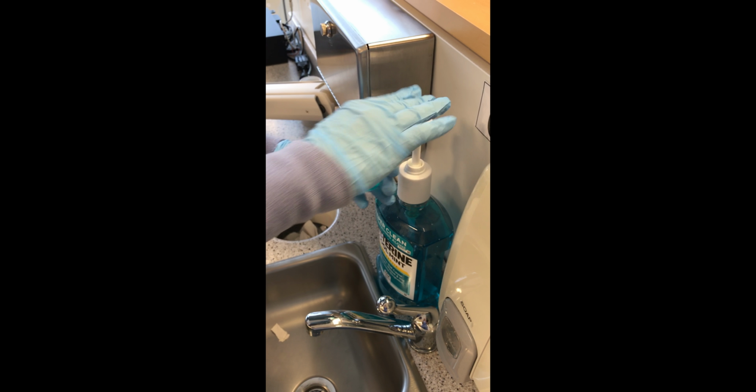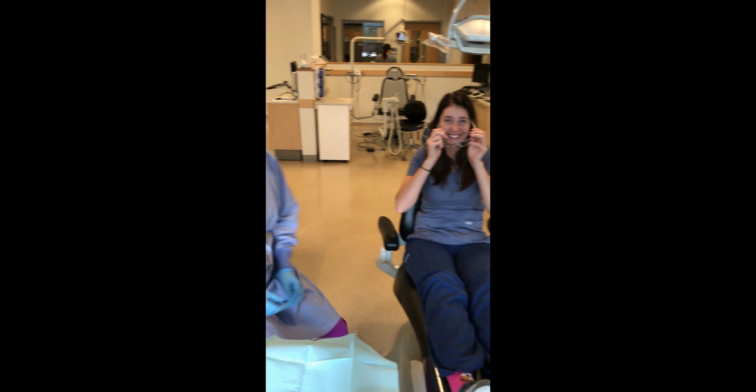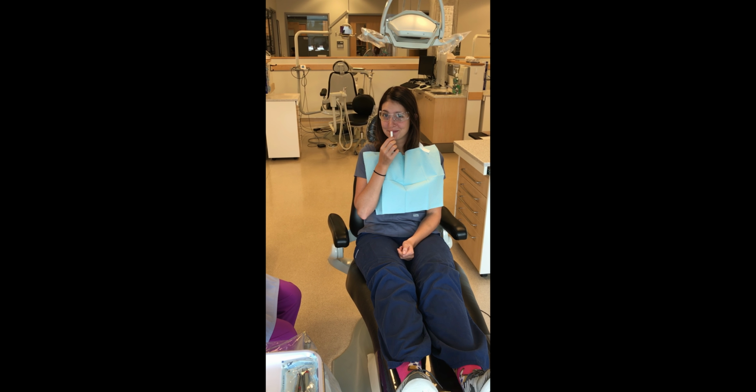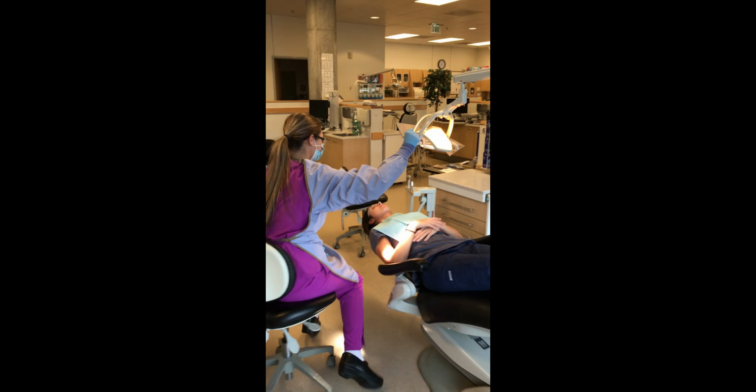Have patient use pre-procedural antimicrobial rinse. Provide patients with protective glasses, bib, and petroleum jelly for their lips. Place patient in supine position with appropriate overhead lighting.